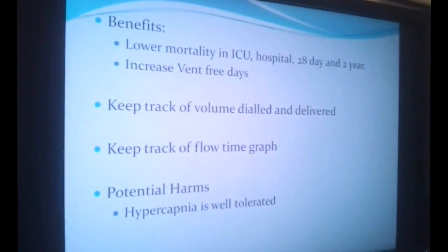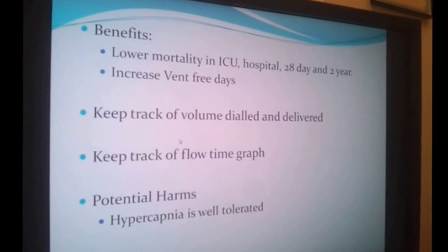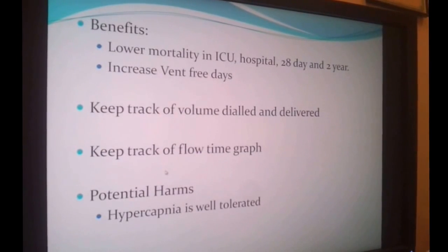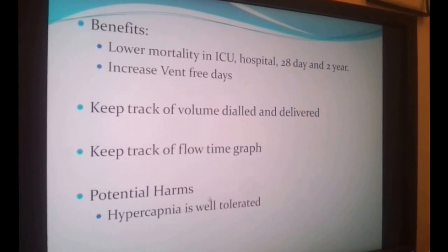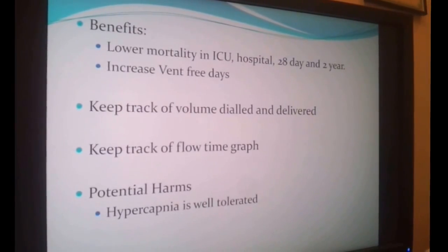Or simply it might be that the flow through the ventilator is not enough to reach that volume, or the time you have given for the ventilator to get that air in is too short. So just keep track of all these things, and how to monitor this will go on further with the changes. Keep track of flow time curves. This will give you a good idea of what volumes are going in and whether they are going in an appropriate time manner, and what the potential harms of low tidal volume are. Low tidal volume essentially means that you are giving low volume, so your CO2 might go up.